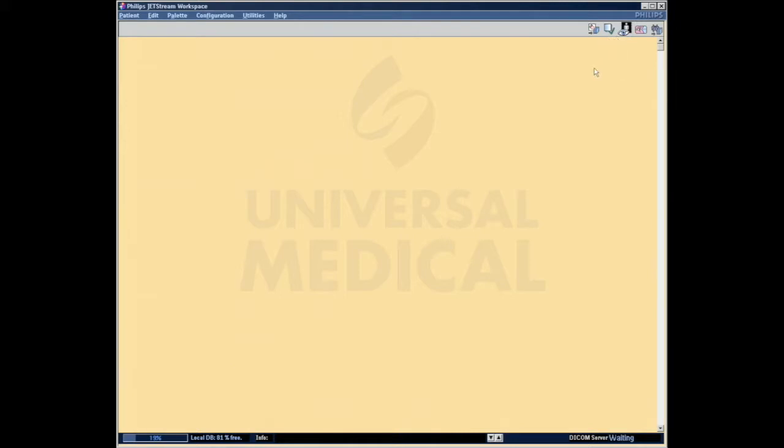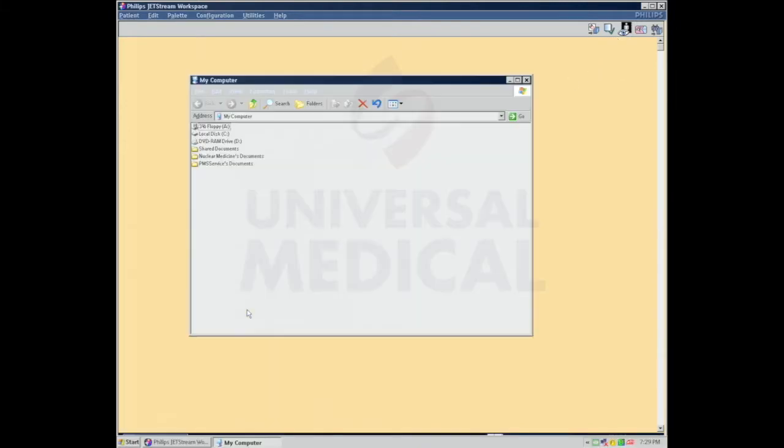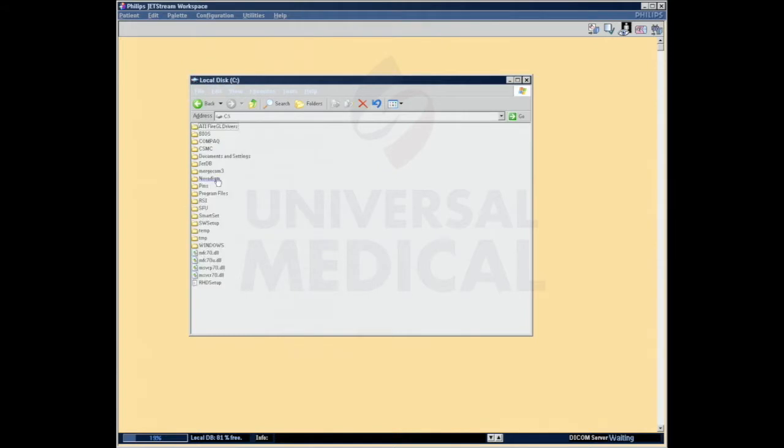If I go look at where the patient data is stored, it's actually stored in the JetDB directory. So here are the studies for this system. So why in some cases do we have a condition where my database or my drive seems to be exceedingly full, yet I don't have that many patients on here? One of the issues is that when things are normally deleted, there is what I call residue left.